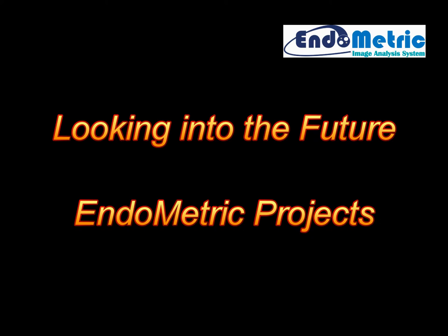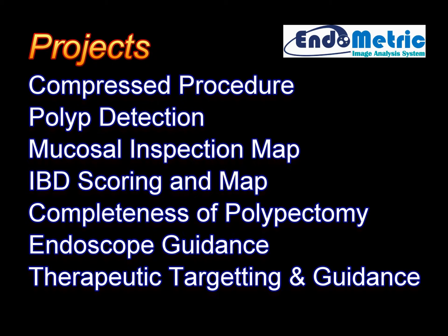Now let's look into the future. EndoMetric is working on a number of projects that may interest endoscopists. Here a list of examples.